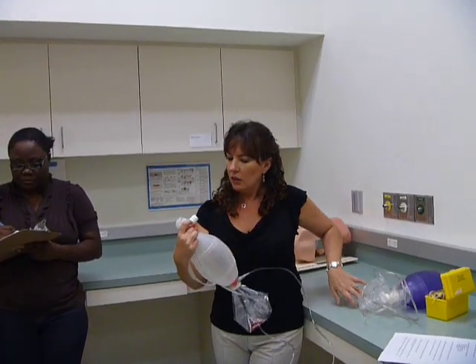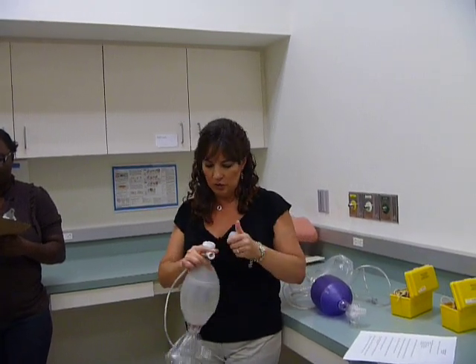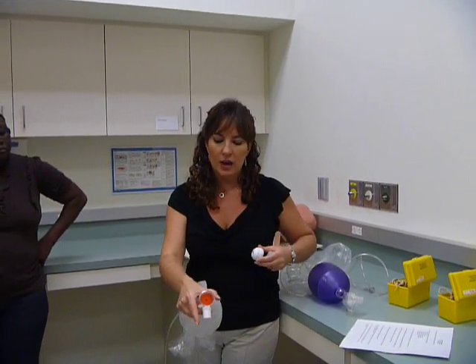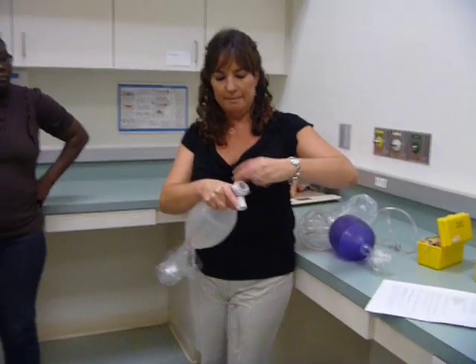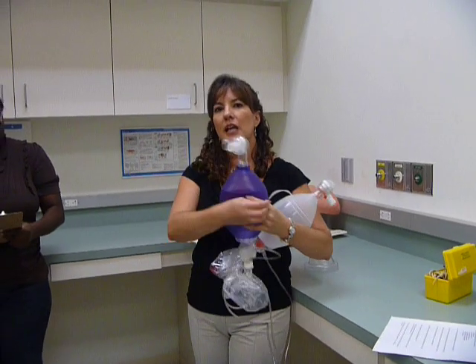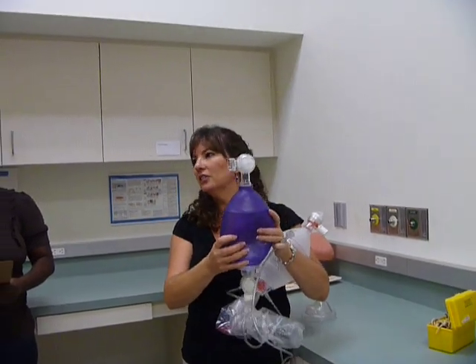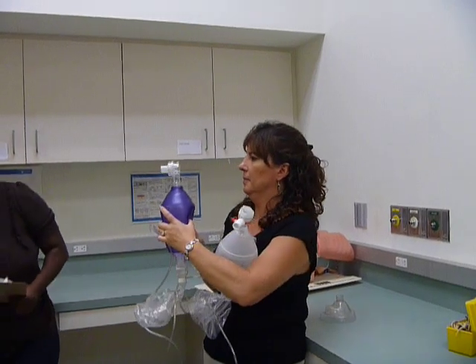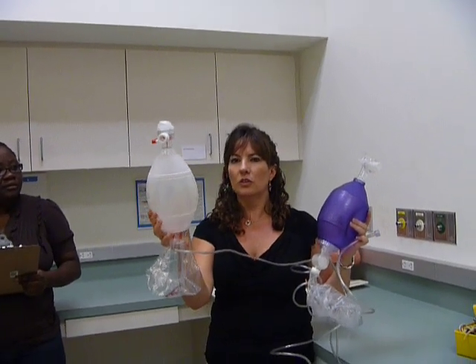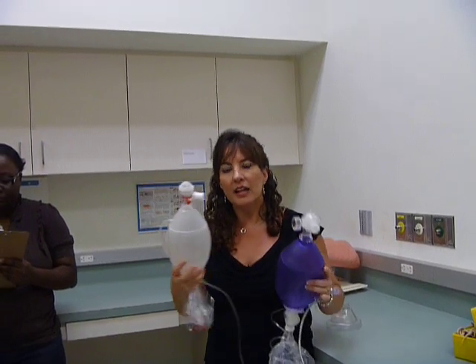Resuscitator bags have different types of exhalation valves. This one, if I unscrew it, you'll be able to see it has a diaphragm — a diaphragm exhalation valve. You see the orange piece? Then this one, when you squeeze it, looks like a duck bill, and that's what it's called — a duck bill. See how you squeeze it and it opens up. This one's a diaphragm. See how you squeeze it and it pushes the diaphragm forward, but air can't go back into the Ambu bag. That's what the exhalation valve is about.